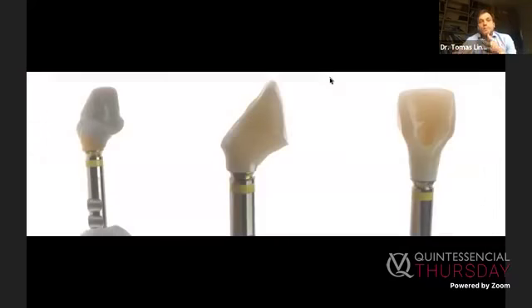And when the implants heal, that's a different story. Then we can play with the tissues, and like everybody, I think, said today, with a healed implant we should not be so scared of pressure on the tissues, because pressure on the tissues, in my opinion, is really important to develop adhesion, how the tissues contact our abutments. And if there is no pressure, you won't have stability, you have flabbiness of the tissues.